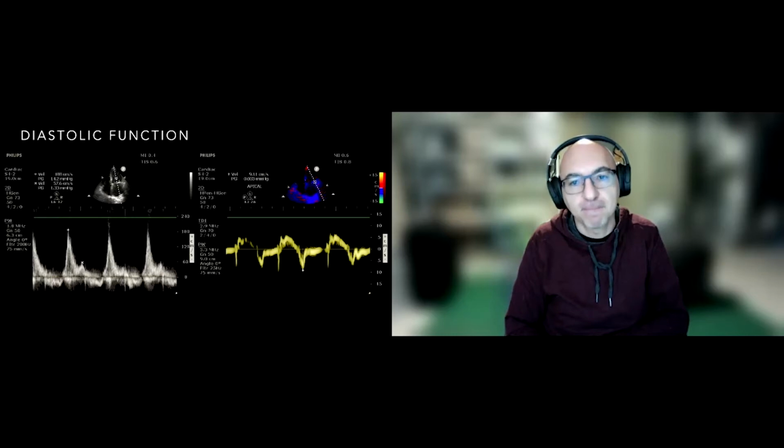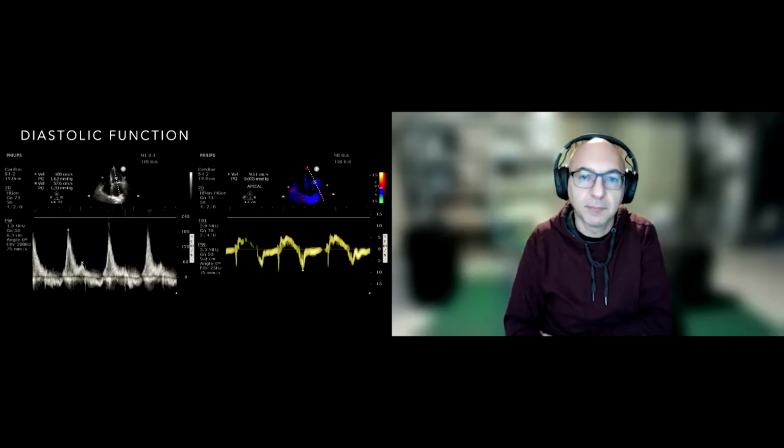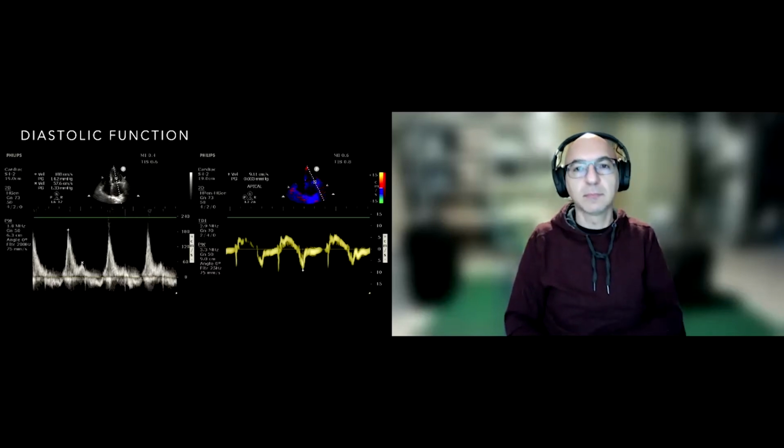Yeah, and you kind of preempted my next question, and maybe I'll just say it, and you can recap and add nuance to that. We've been talking a lot about specific ways of measuring things. Here's a new thing to measure. Why do I care? In this patient, why should I take the time to measure diastolic dysfunction?